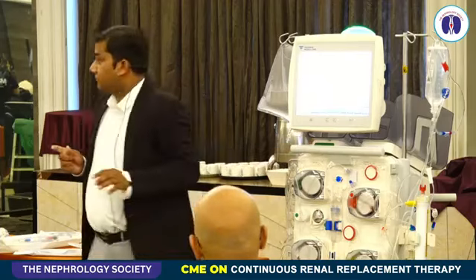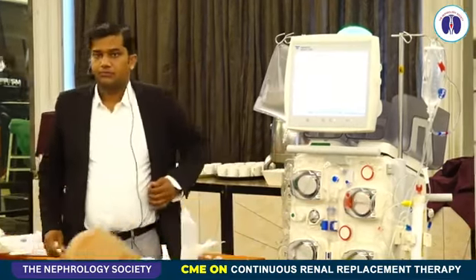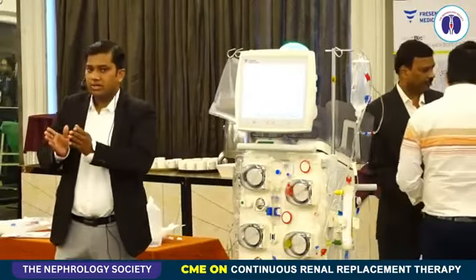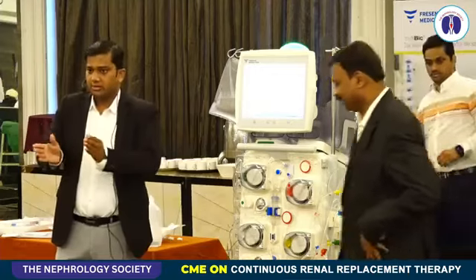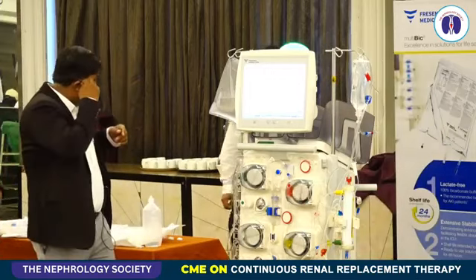So other than that, we have this ECMO. We can integrate this with the ECMO. There are 2-3 types of configuration. The best combination is before and after the oxygenator, like the artery will connect before and the venous after. So this is the best. Probably he would be able to see.